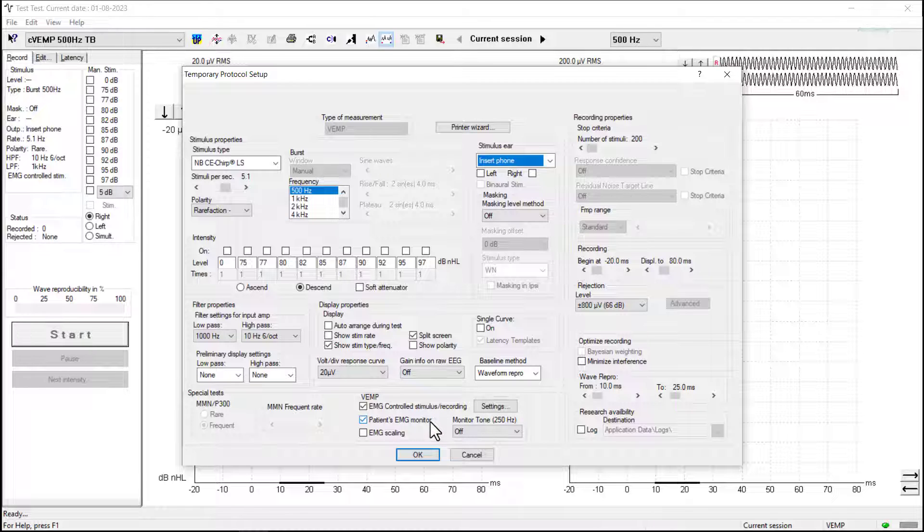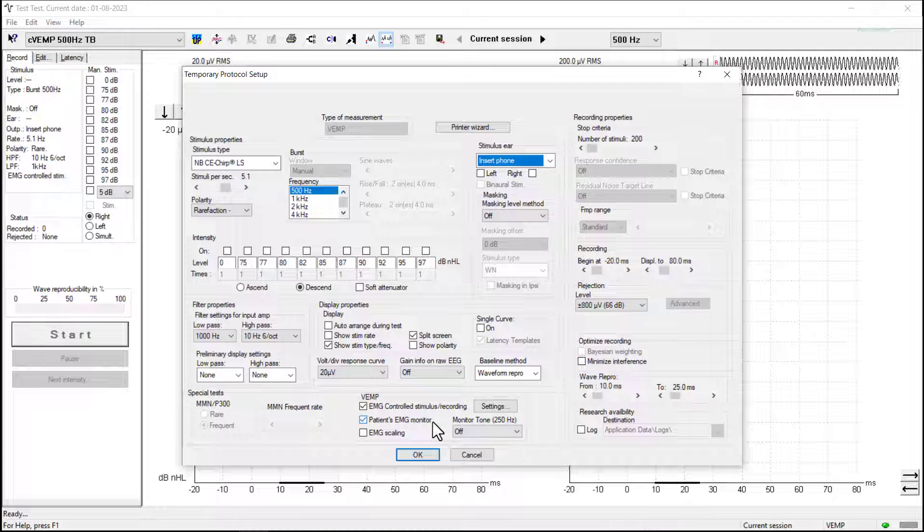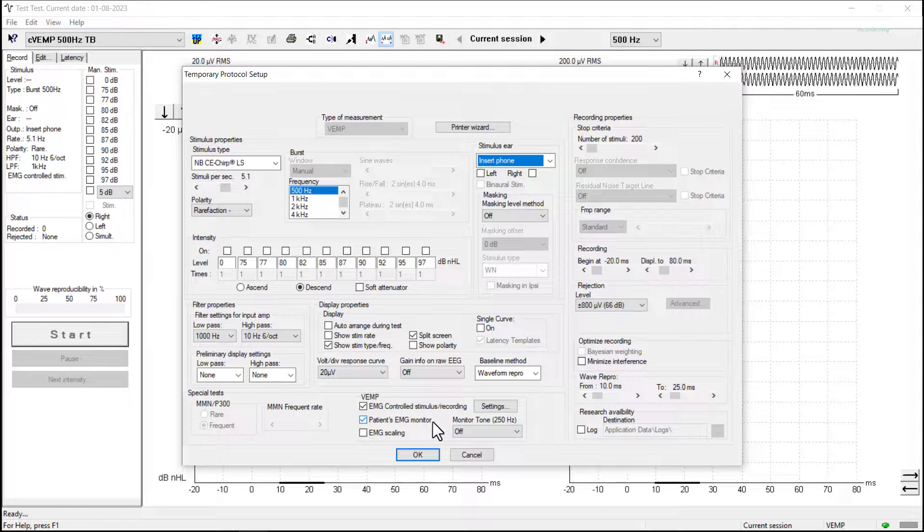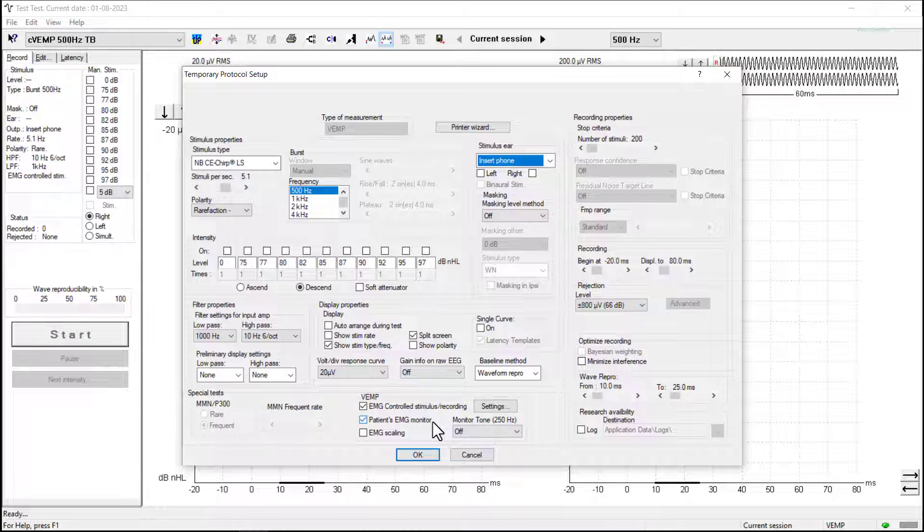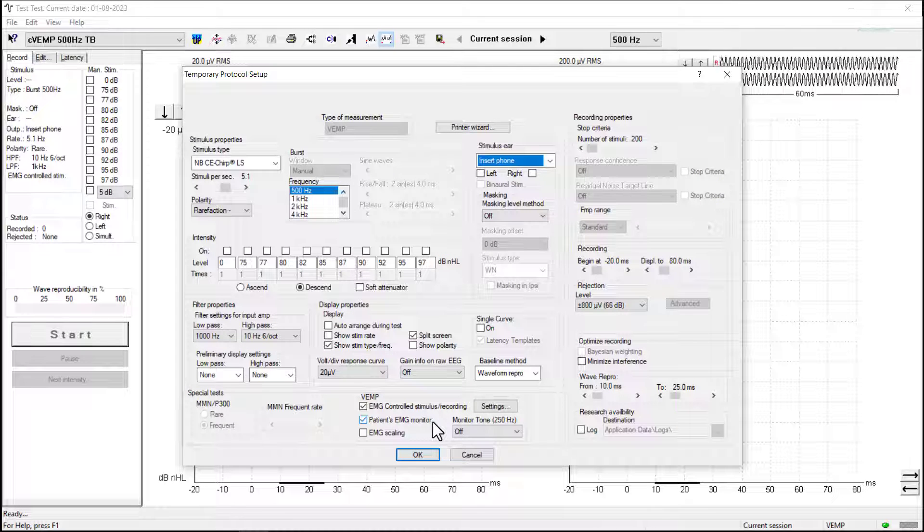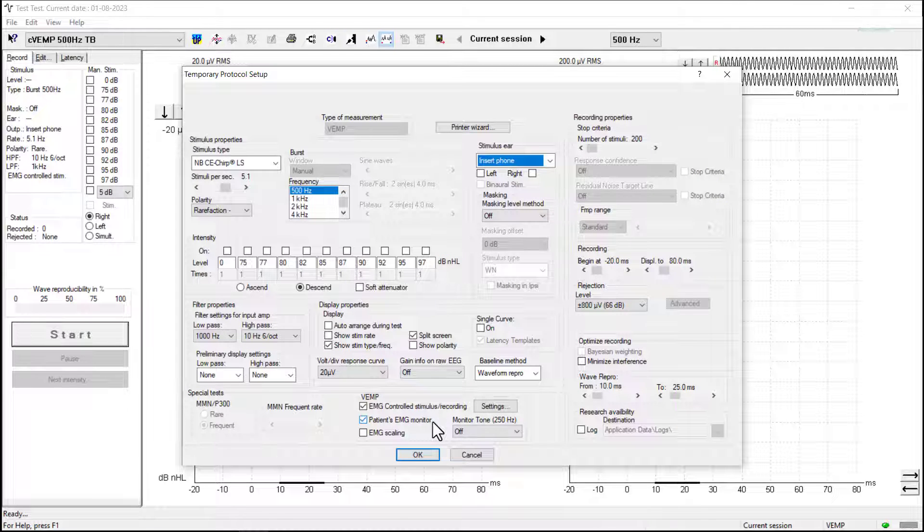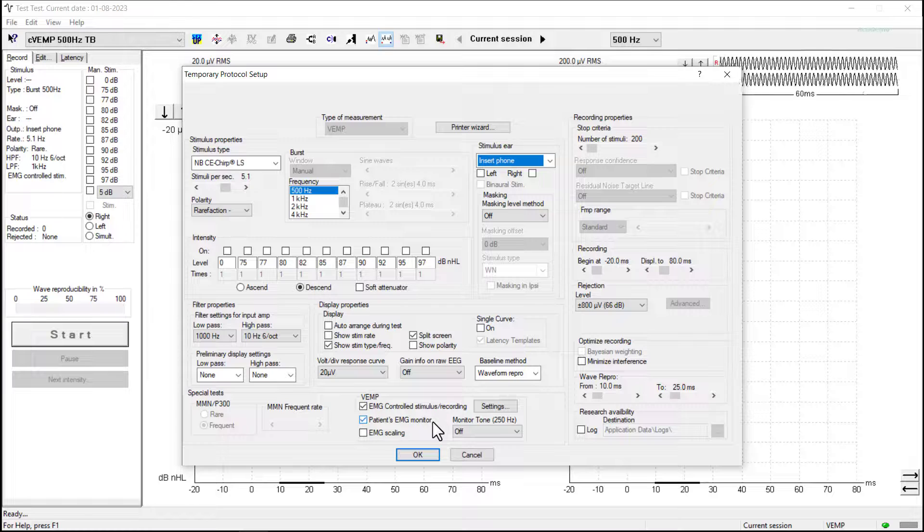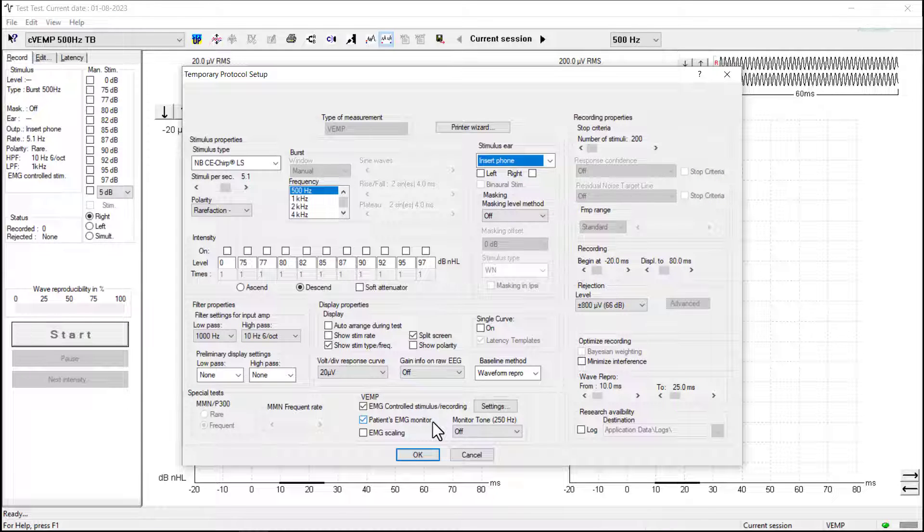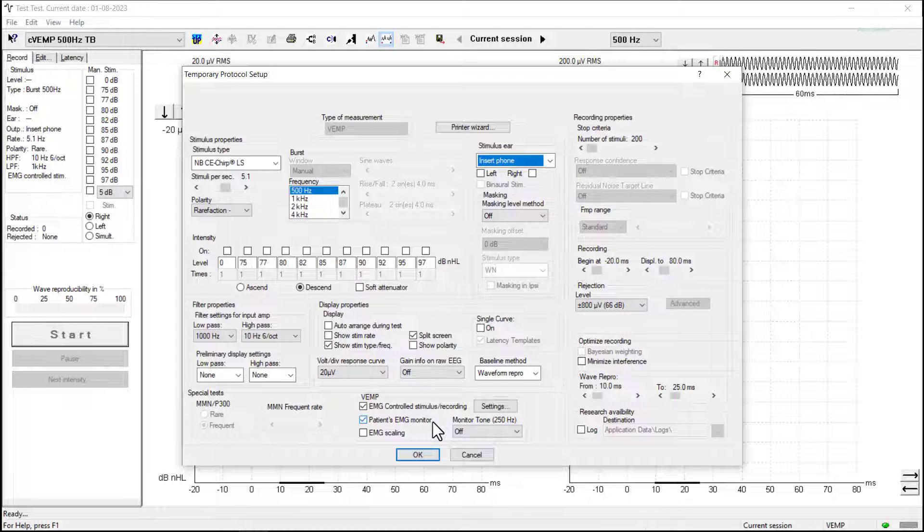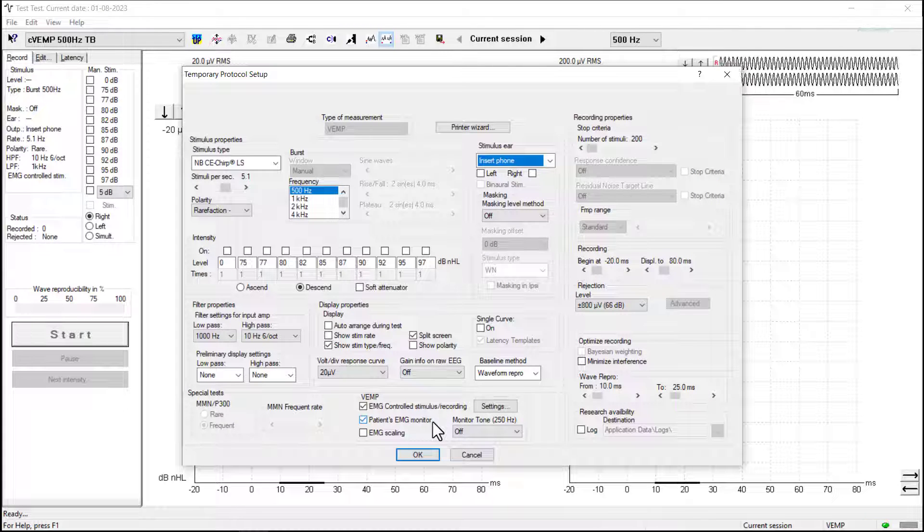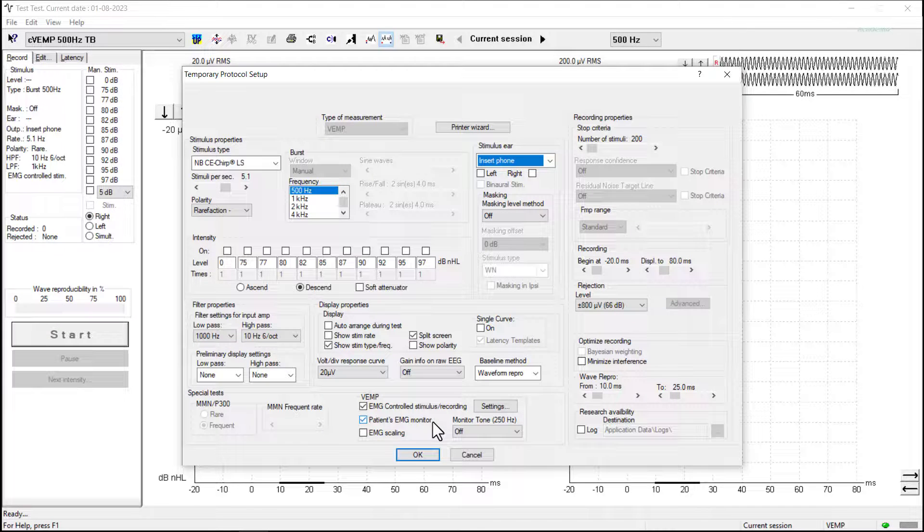The patient's EMG monitor option provides an additional visual indication of whether the patient has achieved the appropriate EMG contraction. This is displayed as a visual bar on the screen and the range of this can be set specifically for each patient if need be.